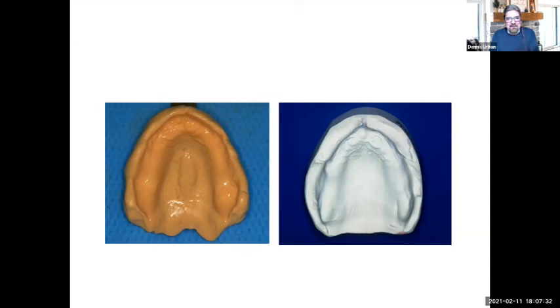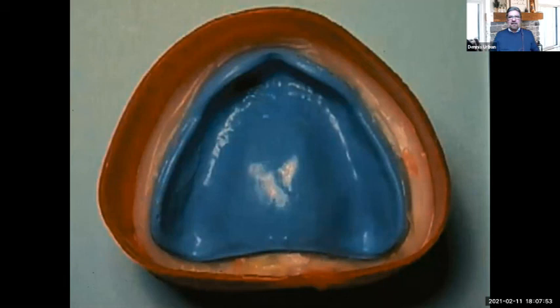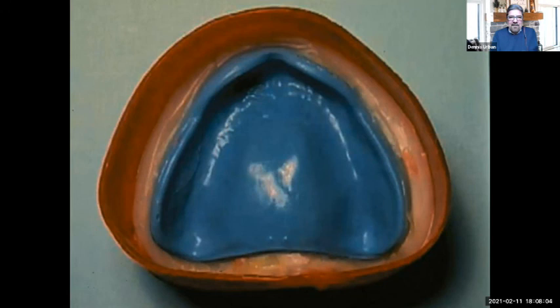This is that functional impression I talked about earlier — bite registration and functional impression with nice border molding, using a heavy body material with all the anatomical landmarks captured. So it's going to be a successful case. When it comes back to the laboratory, we're going to bead, box, and pour these models — we want to preserve all that trouble you went through to give us the nice anatomical borders and musculature by boxing our impression and pouring models.